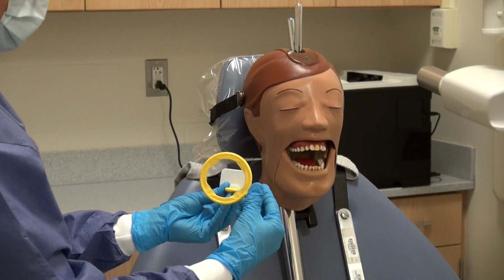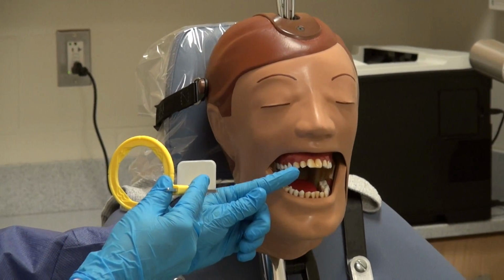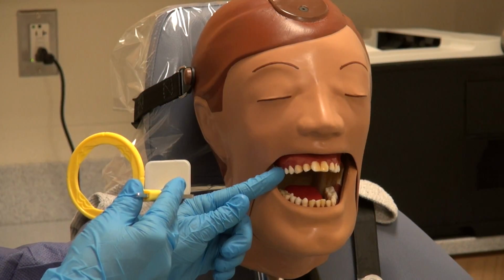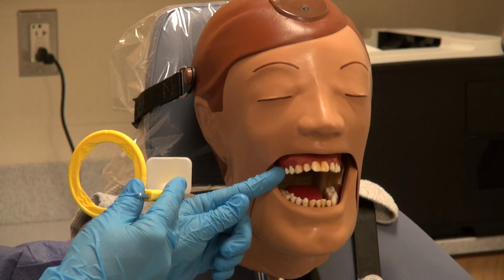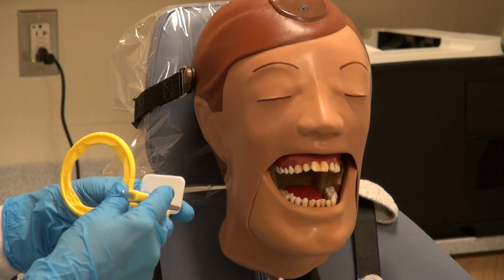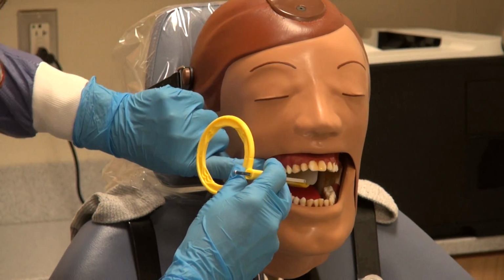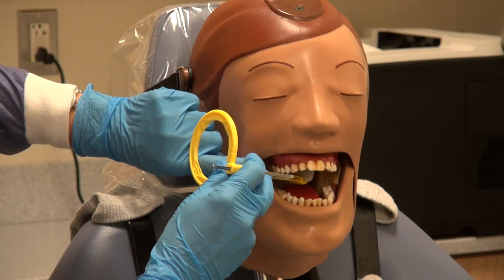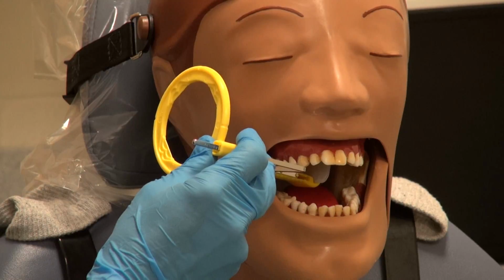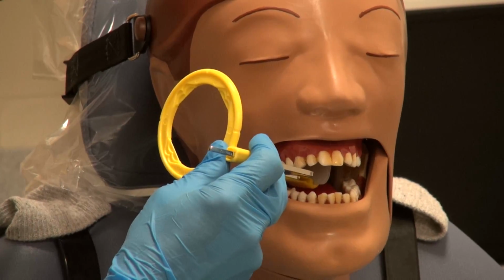Since this image should include the distal of the canine, we want to cover with the film packet the entire canine, first premolar, second premolar, and part of the first molar. Again, being aware that the maxillary teeth are tipped palatally, we're going to put the film in flat, retract the commissure, looking through the ring to make sure that the entire canine is covered. Lift the bite block to meet the occlusal surfaces of the teeth, and close Dexter gently.